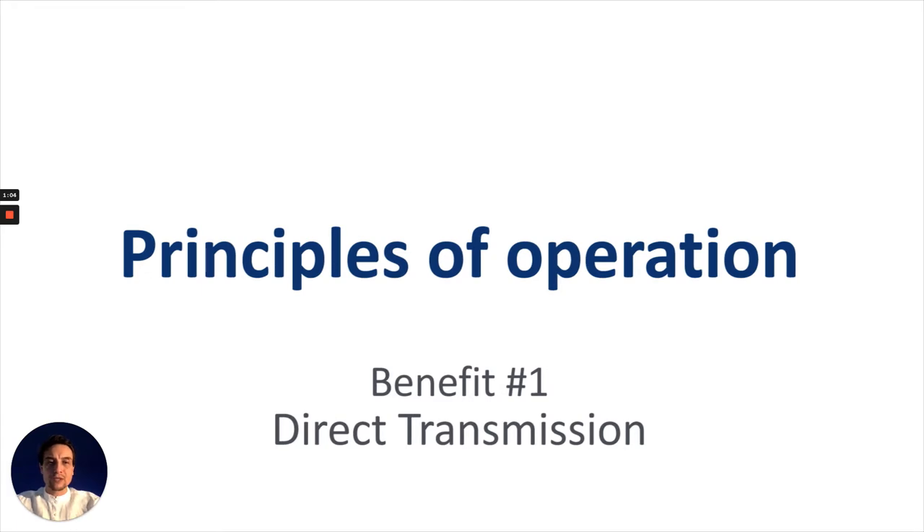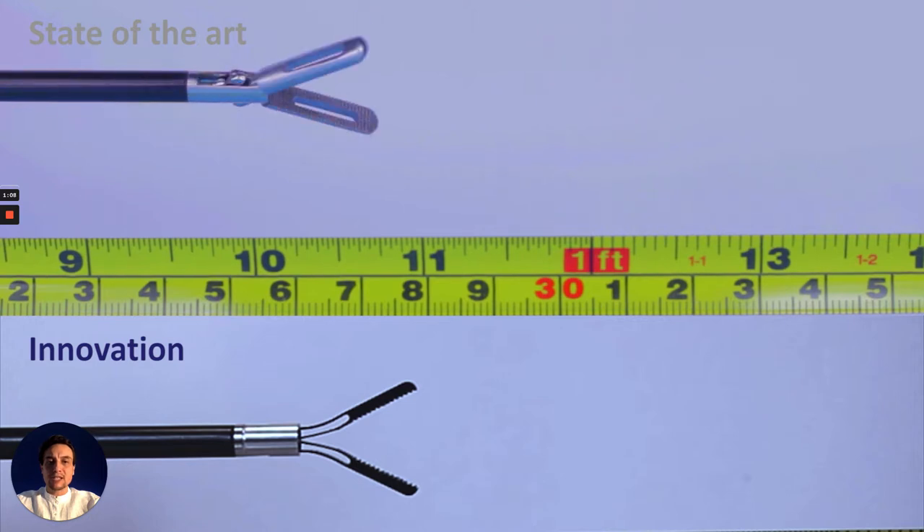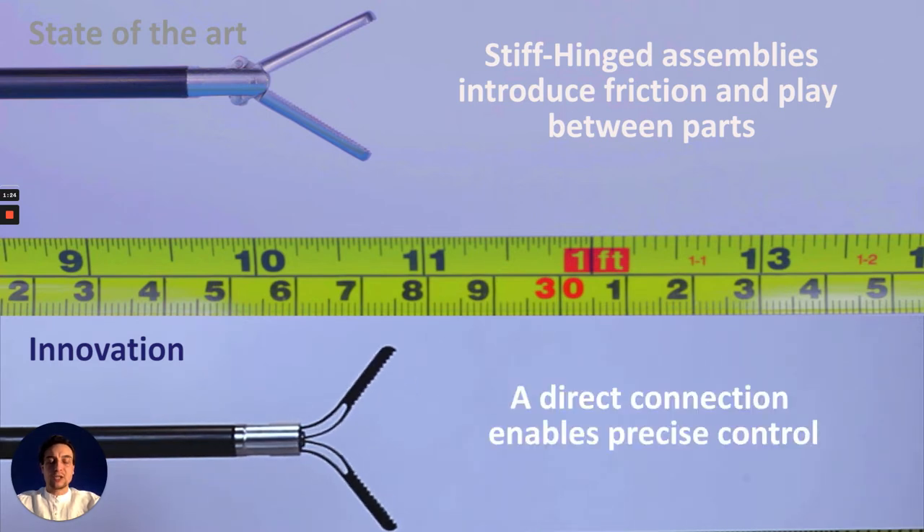In this demonstration video, we replace the conventional rigid body mechanism tooltip with a single-piece compliant mechanism tooltip. The principles of operation remain the same, whereby the conventional stiff-hinged assembly introduces friction and play between moving parts. The compliant mechanism tooltip eliminates that friction and play while enhancing control between intermediate positions.